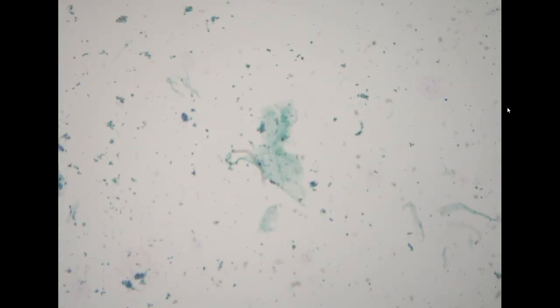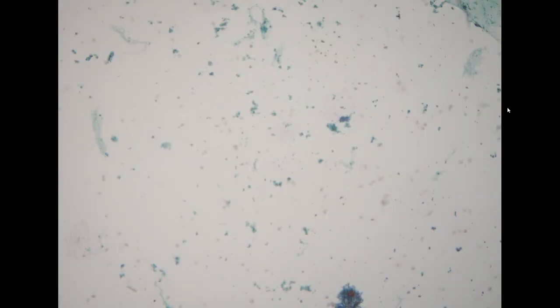So next we have a couple of thyroid fine needle aspirations. This is a liquid-based preparation. On low power, we don't see any colloid.